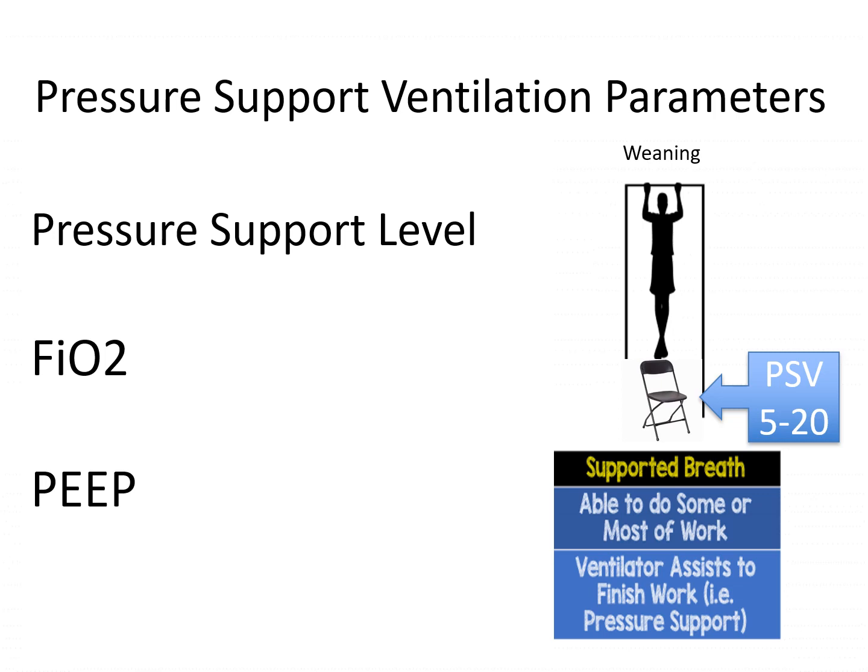PEEP is good because we want patients to maintain their alveoli open and not collapse completely. So usually you'll start with a PSV higher, and again, it can help the patient so that they don't get too tired, and as soon as you come down on the PSV, it slowly brings them to the point where they're at a level as if they're breathing on their own. So again, all their breaths are spontaneous, and their rate will be variable as well as their tidal volumes.